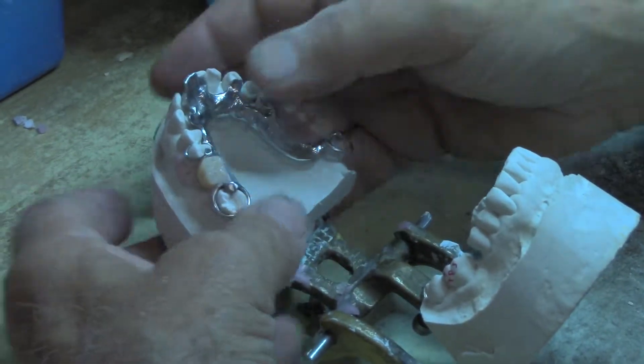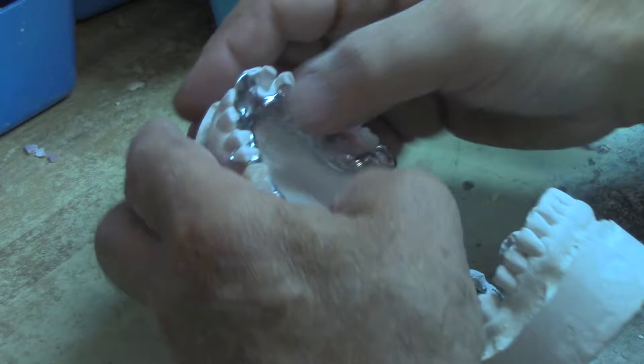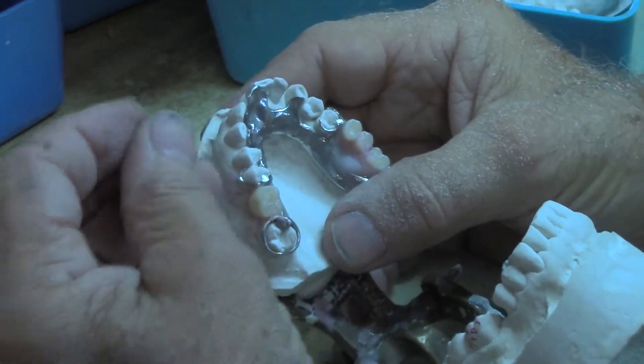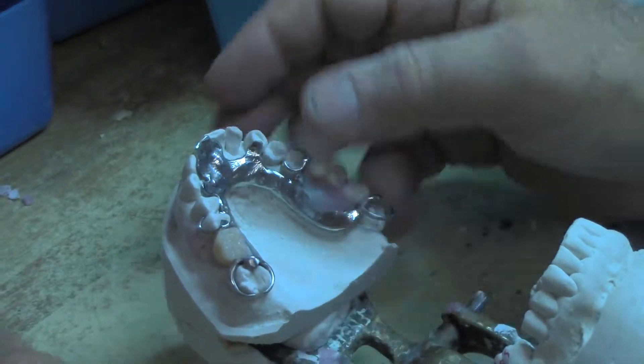We've finished our casting. I fit it to the model, I've waxed up my teeth on there, and I have my facing that's going to go on the end of it. I've taken it off right now.